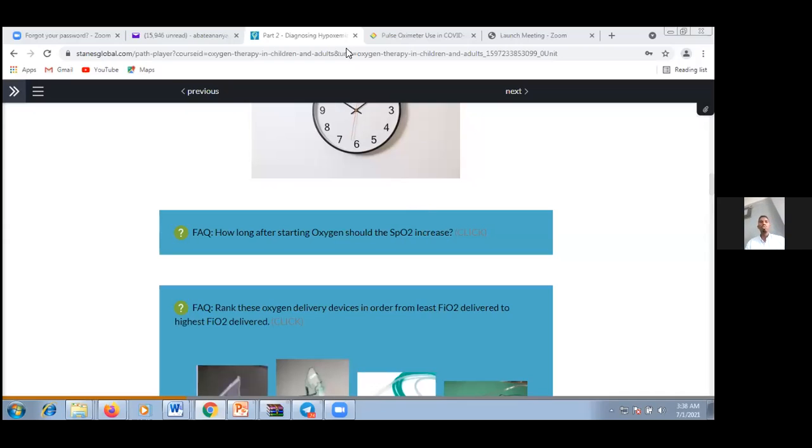The same is true for desaturation time. In patients who have been on oxygen, if there is any discontinuation of oxygen or failure of ventilation, there is a delay to detect desaturation below 90%. It's estimated to take 100 seconds, which means about 1.something minutes, to detect the decrease in oxygen saturation.